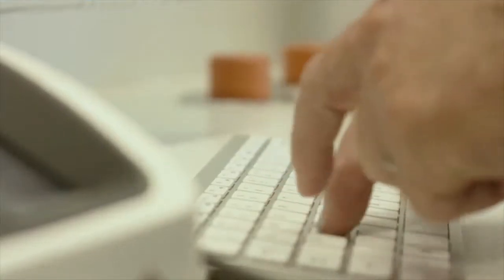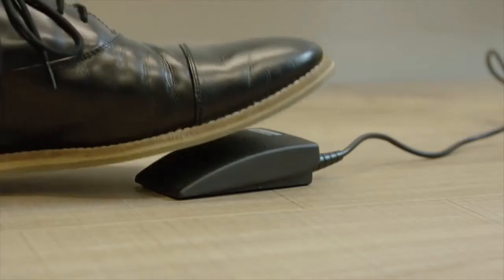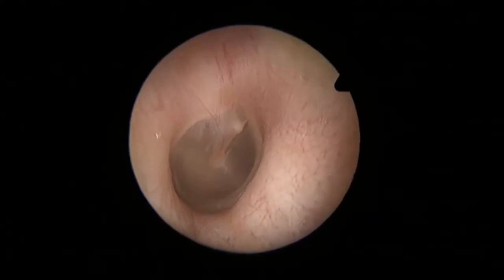Touch screen control or operation via a Bluetooth keyboard or handheld remote allows for fast and simple operation of the software. Footswitch operation allows hands-free capture of still images and live video.